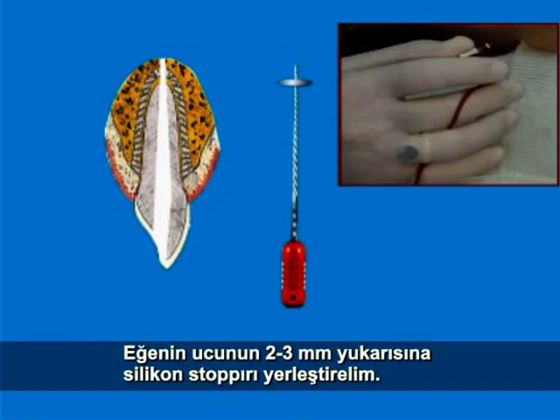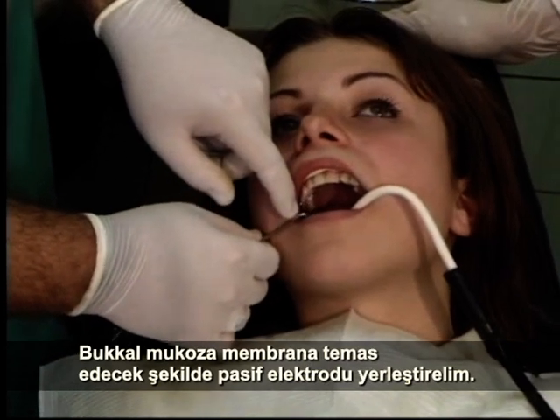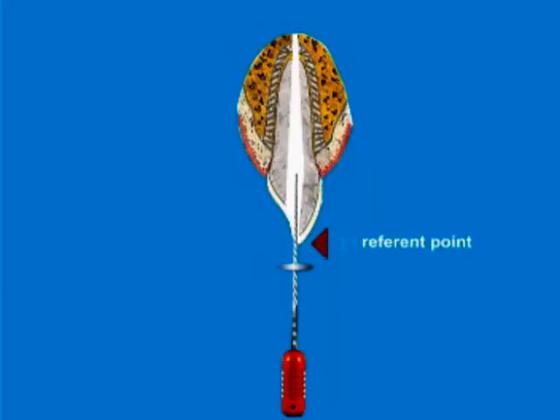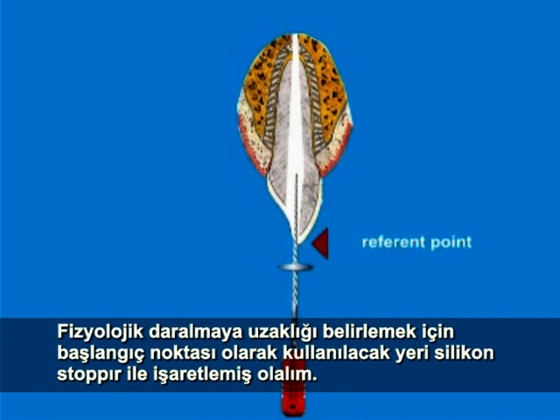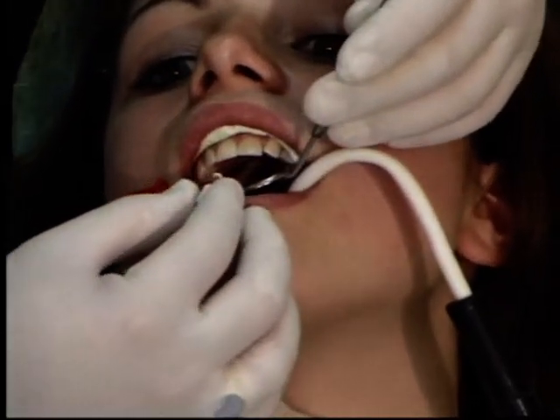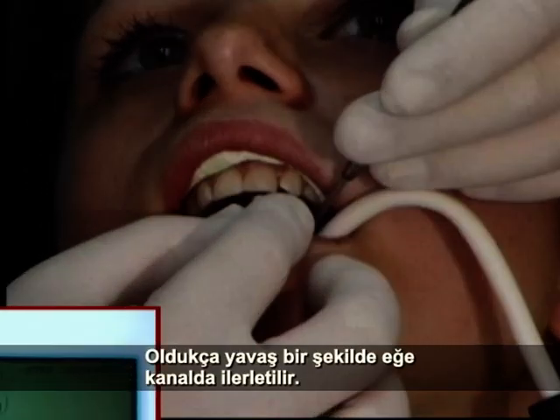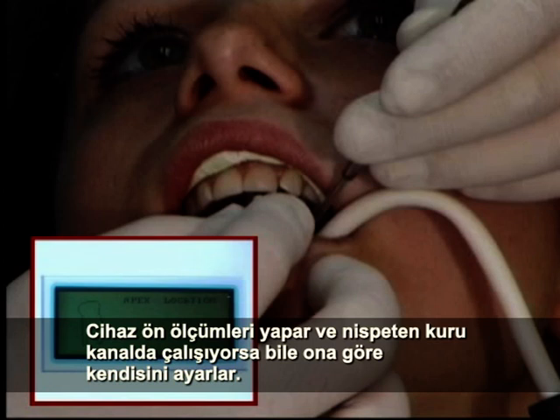Put a rubber stop on the file 2 to 3 millimeters across the tip. A passive electrode is put on the buccal mucosa membrane. Mark a point where we will set the rubber stop and which we will further use as a starting point to determine the distance to the physiological constriction. Then follows gradual insertion of the file. The insertion is slow with easy forward movement. The device makes preliminary measurements and is self-tuned to work in a relatively dry canal.